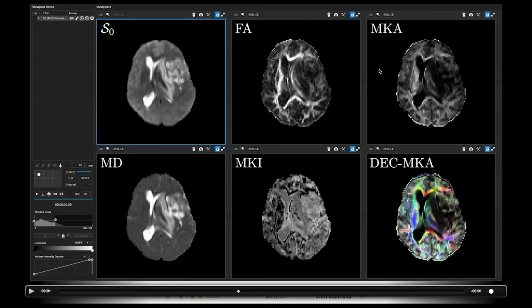Finally, this is the directionally encoded color MKA map, whose color is given by the orientation of the average intravoxel diffusion processes, and the intensity is given by the MKA. Note that in gray matter, this map shows up white, because there is microscopic anisotropy but the elongated cells are randomly oriented over the voxel scale. Thank you very much for your attention.